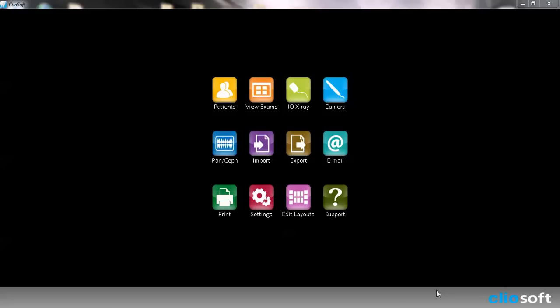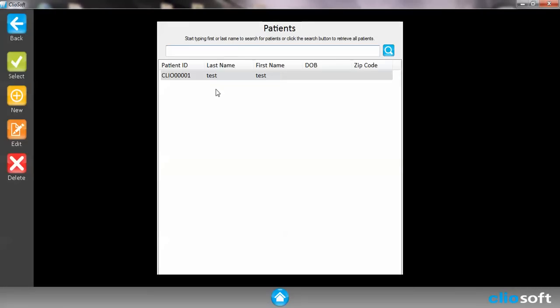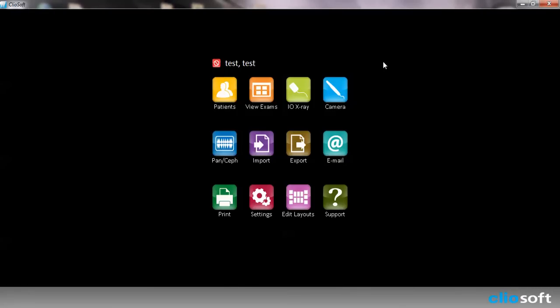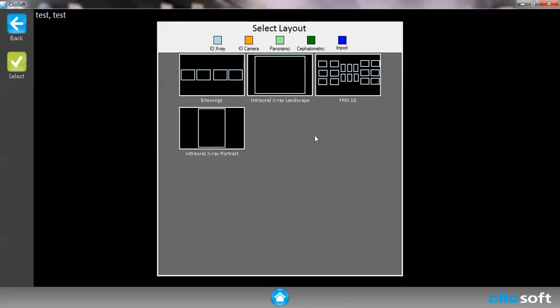Again you'll notice that there's no patients chosen so we're going to go to patients. I'm going to choose my test patients and then we're going to go ahead and get into our intraoral x-rays.